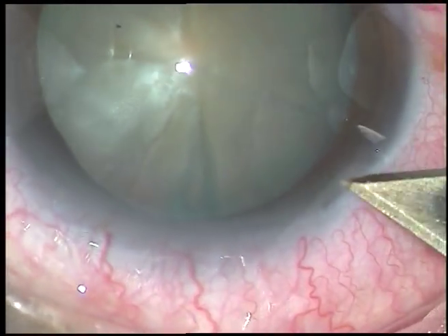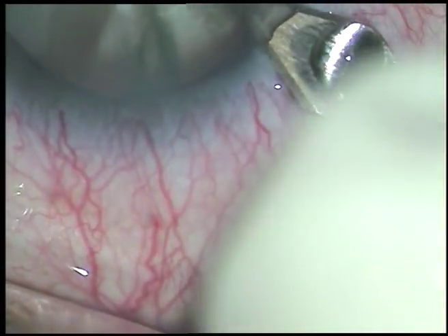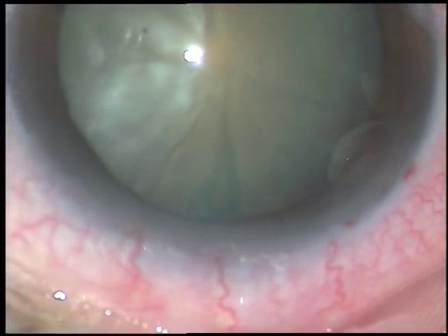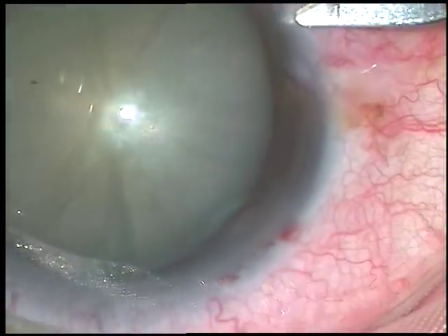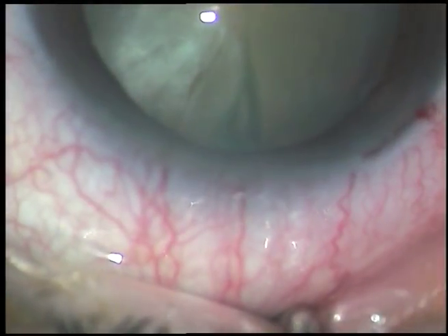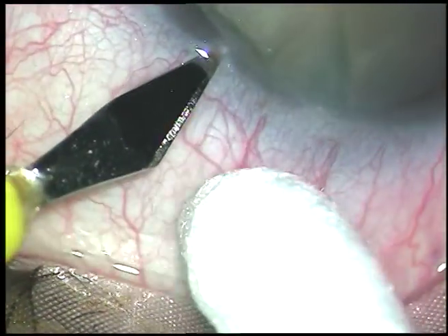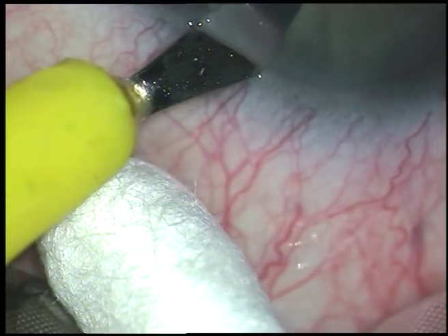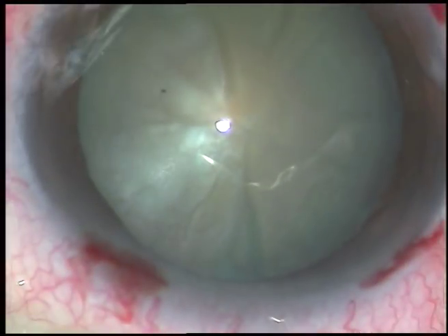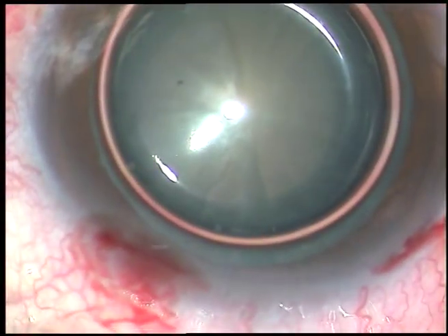Dear colleagues, this is a pre-intumescent cataract. What I mean by pre-intumescent cataract is there is increased convexity of the anterior capsule, there are radial visible water clefts, but intralenticular pressure is not raised and there will be no leakage of fluid on puncture of the anterior capsule. I have taken up this case for surgery. Let us observe the surgical steps.